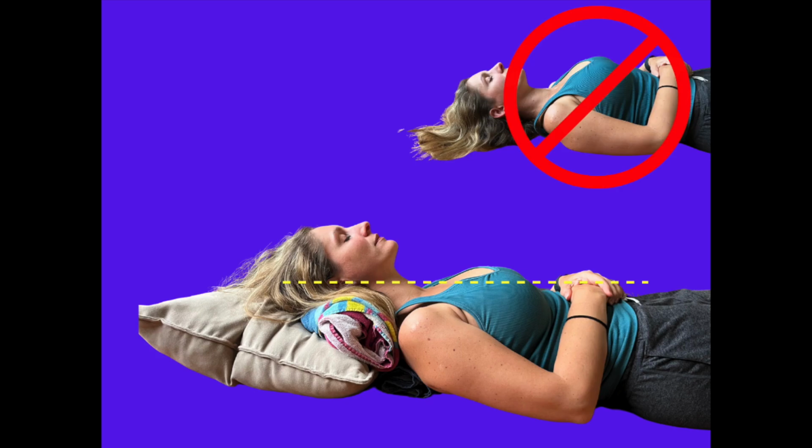Now that you got your equipment prepared, you must position the patient. They must be ear to sternal notch. Don't just head tilt chin lift them like I see most people try and do in pre-hospital intubations. The ear canal, or the auditory opening, or the ear hole as I call it, must be at the level of the sternal notch. This will provide the most optimal view as it aligns the airway axes. And from experience, an easy way to do this in the ambulance is to simply put the stretcher in a semi-Fowler's position and then pad the head and shoulders so that ear to sternal notch position is achieved.